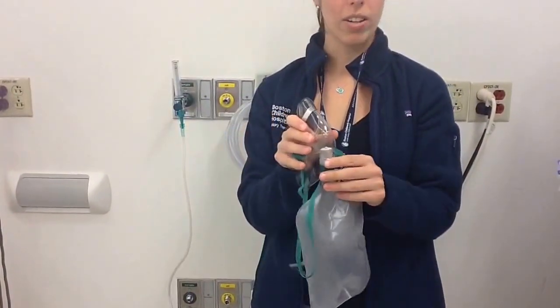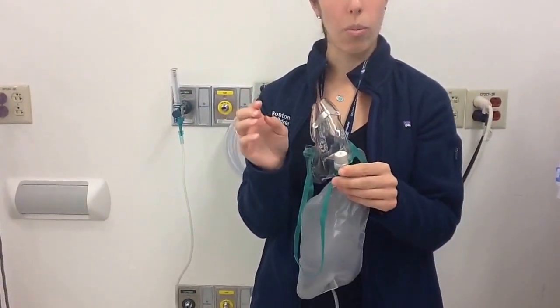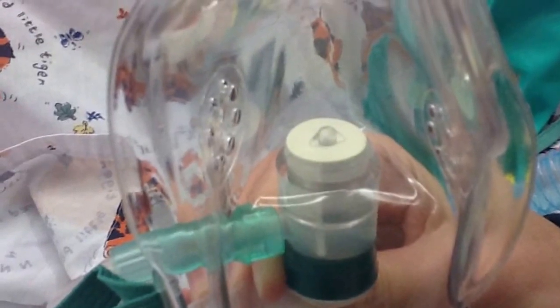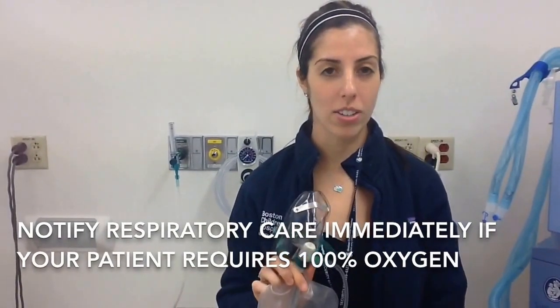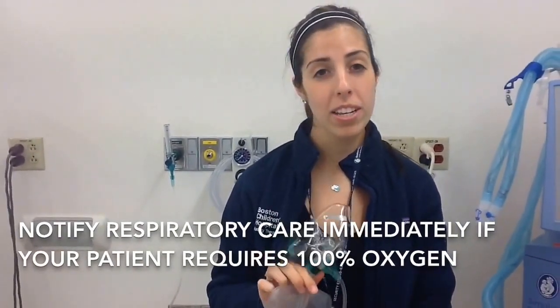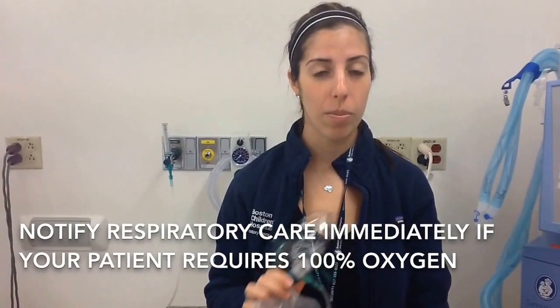When your patient inhales, the one-way valve is going to open and you can inhale 100% oxygen. When your patient exhales, the one-way valve closes so that your patient isn't rebreathing their CO2, and they breathe out through these two valves. If your patient is requiring 100% oxygen, we need to be notified immediately. You can call us at 84920 or page us at 7377 or RESP because they may require higher levels of support.